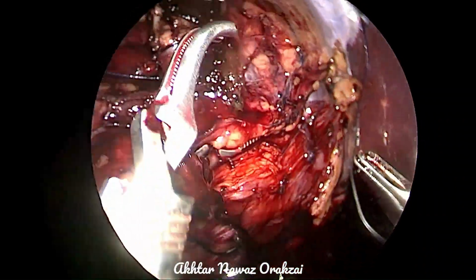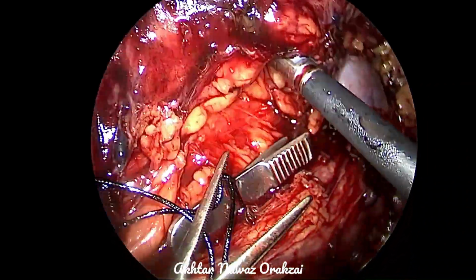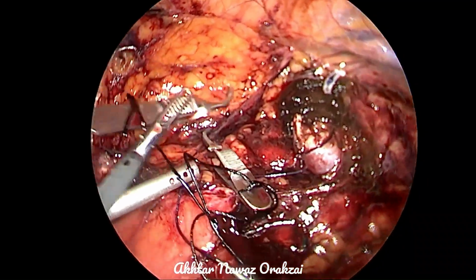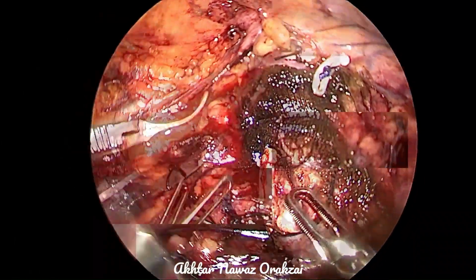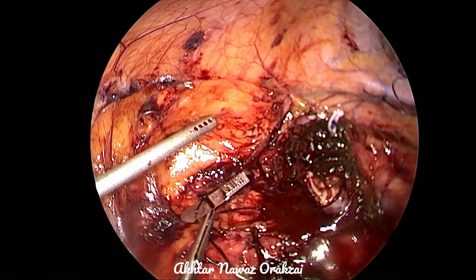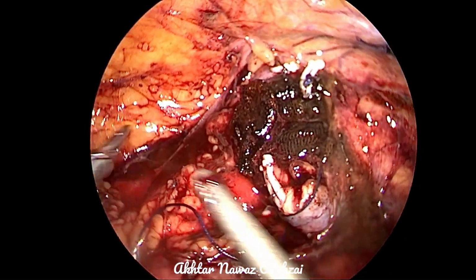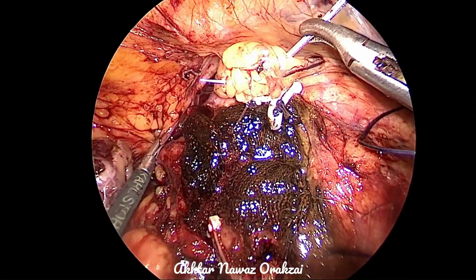Once the repair is complete, we first remove the venous clamp, and then we remove the arterial clamp. And then we look for the bleeding. There is no major bleeding, luckily. Of course, there is a little bit of ooze, and that will be controlled by these sutures and the Surgicel.